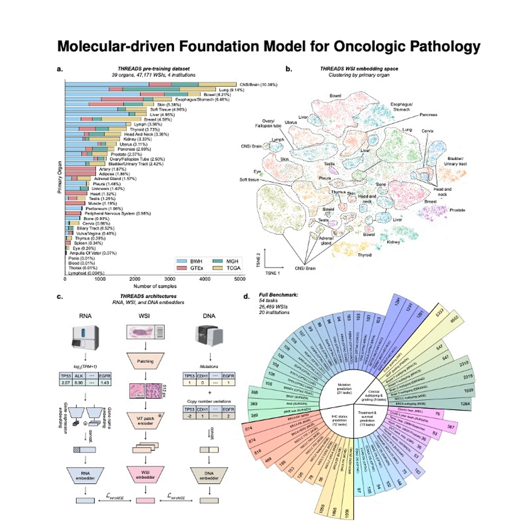Exactly right. It's basically teaching the model, hey, the visual fingerprint you create for this slide needs to be biologically consistent with its unique DNA fingerprint, not just generally similar to other slides. I see. So it forces the visual side to filter out maybe visually interesting stuff that isn't actually biologically relevant and focus on the features that correlate with the deep biology. Precisely. It learns to see what matters biologically.